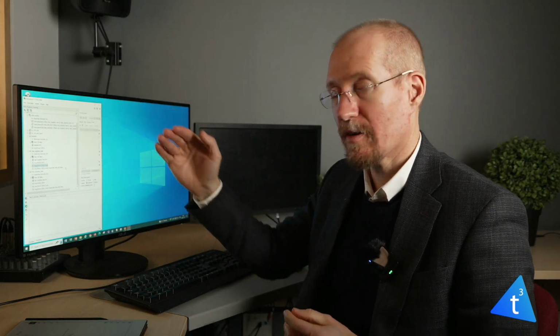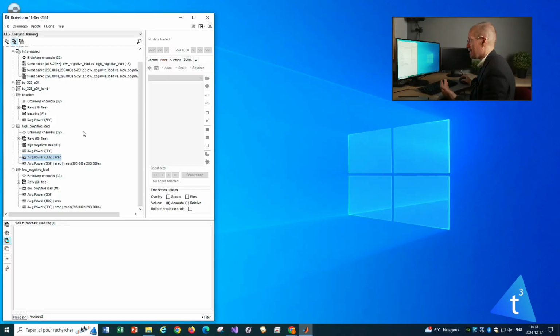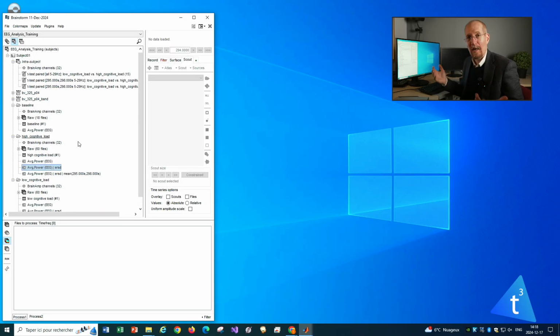So when you go to write your paper, one of the things you'll need to do is write a method section. And in that method section, you will be expected to describe the exact processing steps which were applied to your raw data. So for the most part, I think that's understood from watching this video. But what I mean by that is you don't need to explain that you imported a file into the system. You need to be able to explain things like you visually inspected the data and you checked for dead channels and you removed them if they were present.